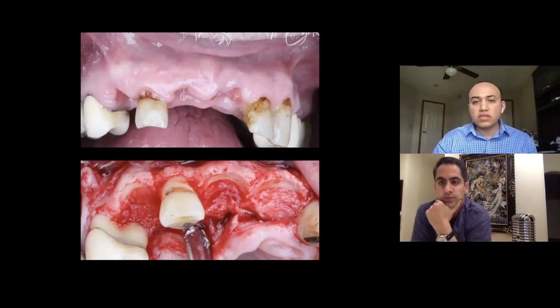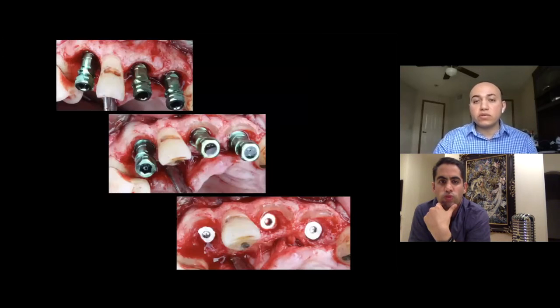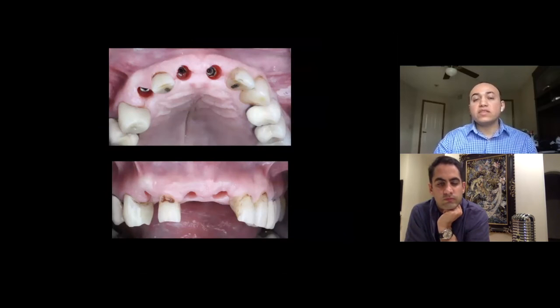You can see the nice shield, but we also have to adjust the shield a little bit after we open the flap. At this point, I'm comfortably opening the flap. I need to see exactly what the shield is. I know that the bone is intact, the bone is preserved, and I want to see the quality of the bone that we got. So we adjusted the shield a little bit, and then we placed our 3 implants comfortably, 2 millimeters away from the socket shield, and then we buried the implants, and this is the final. So very nice thick tissue. Also, the patient improved his oral hygiene and is ready to be restored, and we're restoring the 3 implants along with a crown for that lateral tooth.